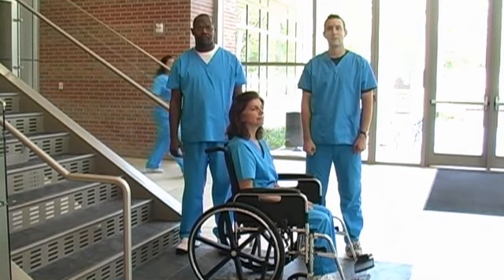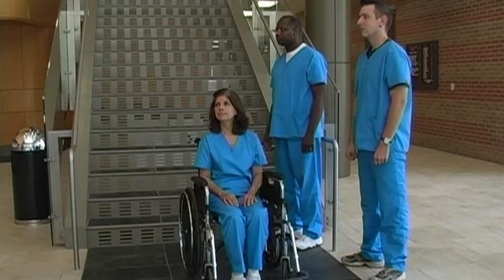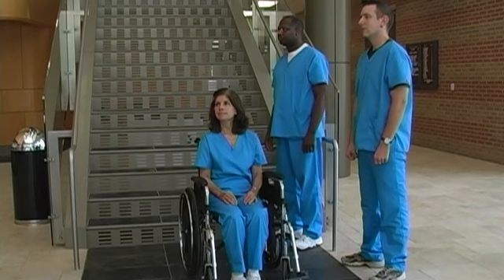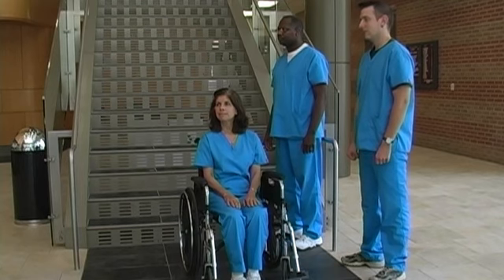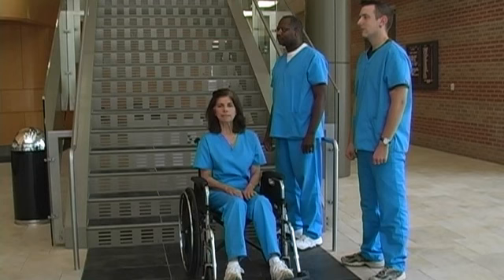Assisted wheelchair up the steps. If the patient requires a seat belt, make sure it is fastened securely before attempting to ascend the stairs. Arms should be resting on the lap, away from the wheels. Feet should be resting securely on the footrest.